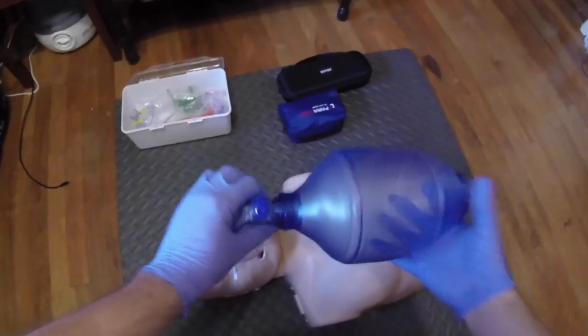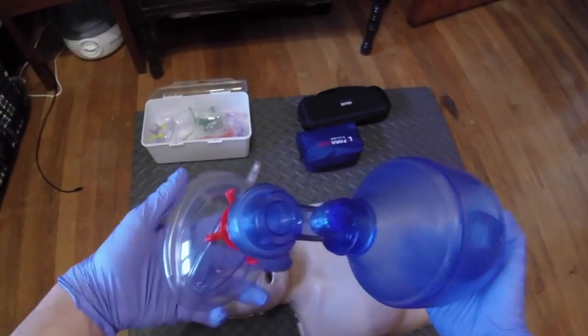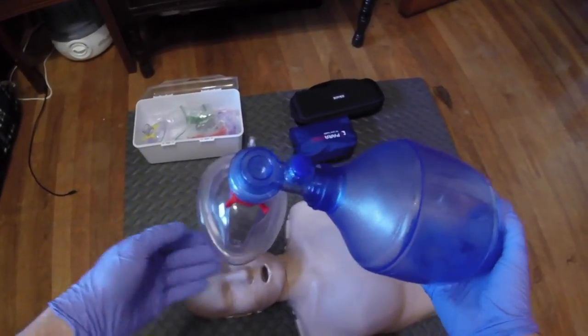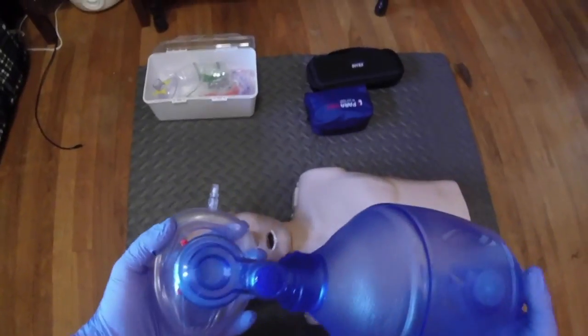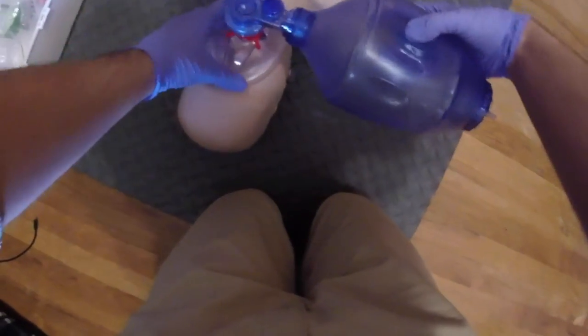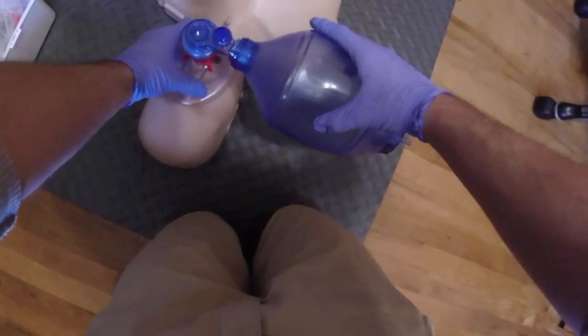The next tool I'm going to show you is what in EMS we call a BVM, or bag valve mask. Basically, this device is used for patients who cannot breathe adequately on their own. So we arrive on scene, the patient is having a lot of trouble breathing and maybe can't do it on their own. We would secure the mask on the face, hook up oxygen to the bag valve mask at 15 liters per minute, secure the airway, and have my partner bag at about 12 to 20 respirations a minute.